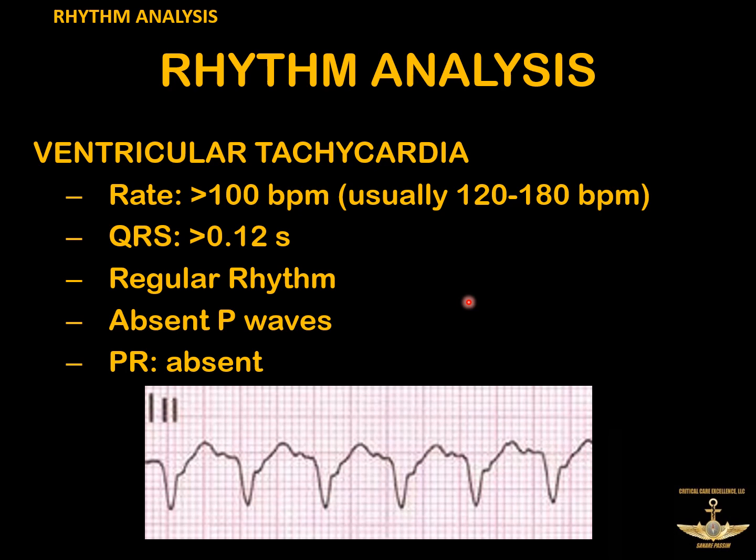If they have a pulse, then we will usually do what we call a synchronized cardioversion. We talked about that briefly with SVT earlier. So use a lower energy level and you will synchronize so that the shock falls on the R wave or the QRS complex. And what this does is it terminates the underlying rhythm with the hopes that it's going to allow the patient's normal conduction system, the SA node, to take back over and establish a normal heart rate.